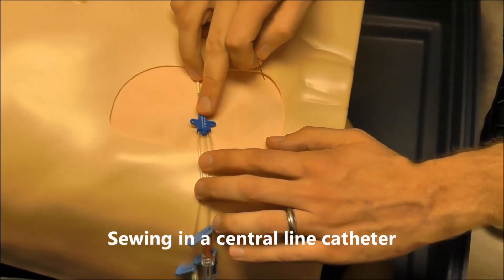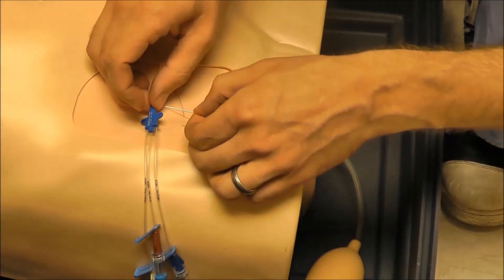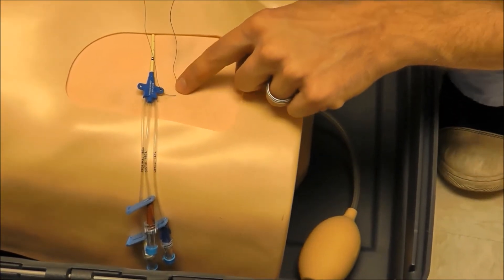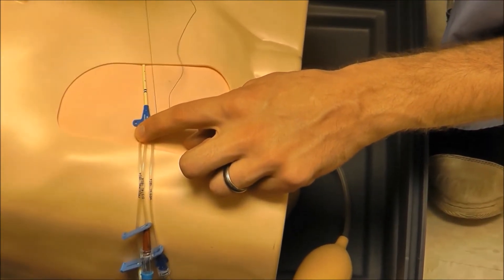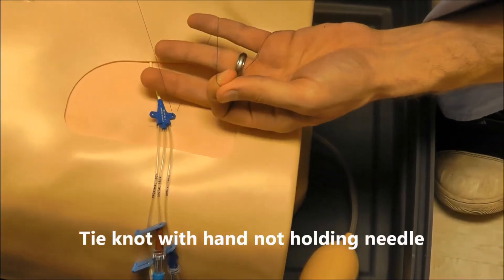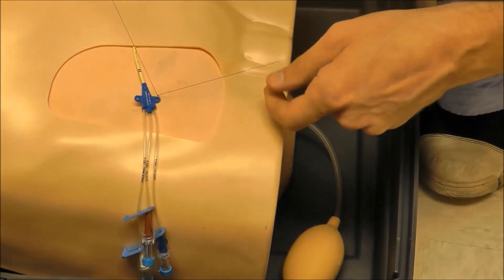Now let's talk about how we're going to suture in this central line. The very first step is to take your needle and puncture the skin in this manner. Then take the needle and go backwards through this little port — this little hole on the side of the central line. Now we're just going to tie this central line down close to the skin. You're going to have to do it on each side, so give yourself plenty of length on the side of the needle. Holding the needle with my right hand, the very first knot is one of these knots. Pull it down close to the skin, but not so close that they won't be able to cut the suture line.